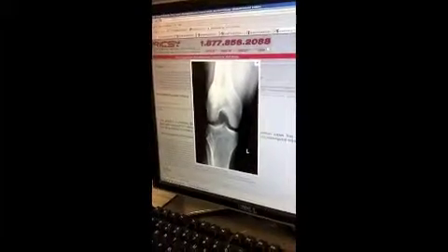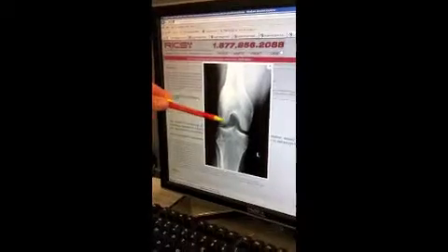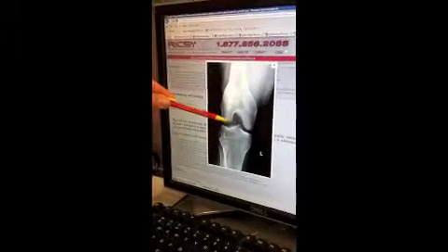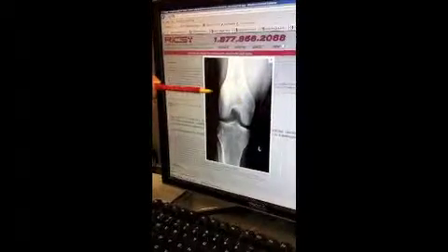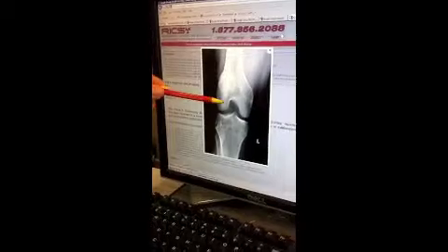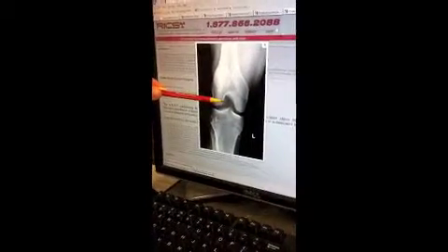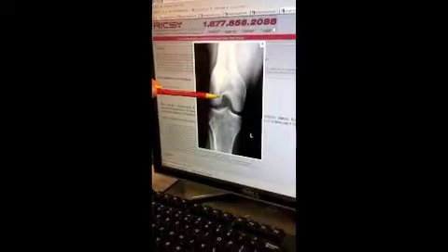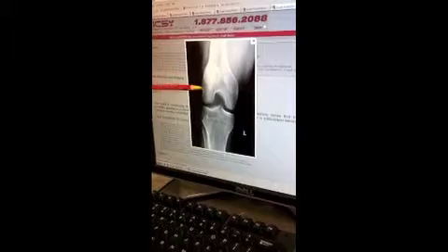For the PA axial knee, Camp Coventry, also known as a tunnel, you want a nice open fossa. You also want to see the posterior-inferior surface of the femoral condyles. You want the intercondylar eminence centered in open femorotibial joint space. The apex of patella not superimposing the fossa. That's clear. And you want no rotation.